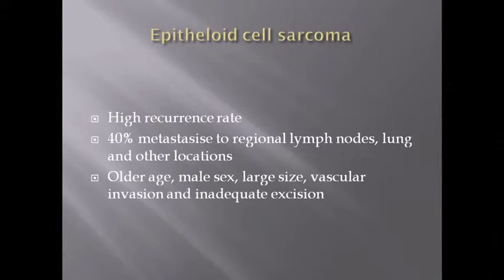They are such ill-defined tumors. And always when you have a punch biopsy or a tiny shave excision from the surface of the lesion, it becomes all the more difficult for the diagnosis to be confirmed, because you're only seeing part of the lesion. So that is the importance of getting a proper representative section, because there are a lot of features which come into play in making that diagnosis.